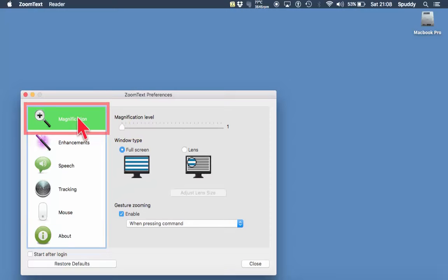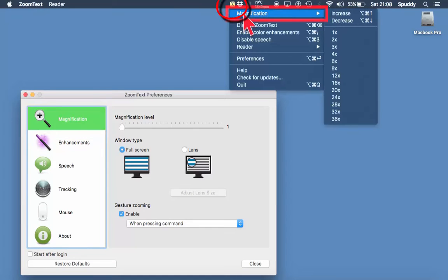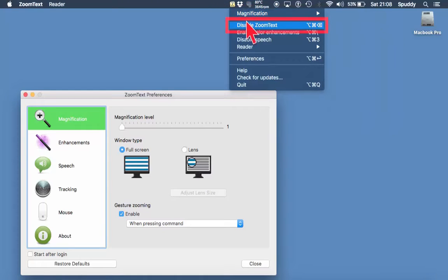Let's have a look at magnification first. I do recommend when using this option to go up to the icon at the top — if you click on it and go to magnification you can access it there as well — but it's definitely worth learning the shortcut keys. So with ZoomText disabled, the shortcut is Command, Option, Delete to turn ZoomText off and on.